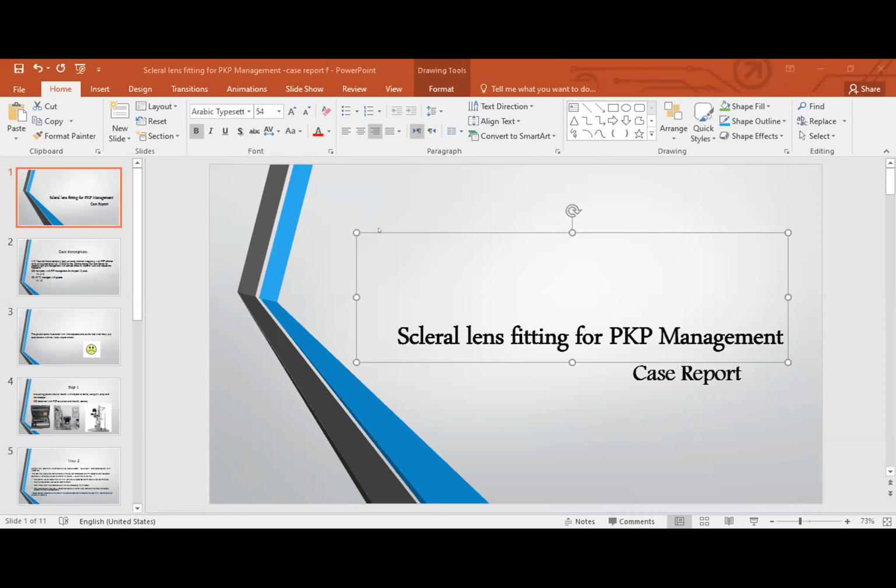Yeah, but I think most of the time it could be because of the angle of wettability. So that could make a difference, and just having the coatings as well could help with the comfort of the patient, which is ultimately what you're seeking. That the patient feels comfortable with the material, and you can provide the oxygen, like Randy was saying, and both of those companies have the same exact oxygen flow.